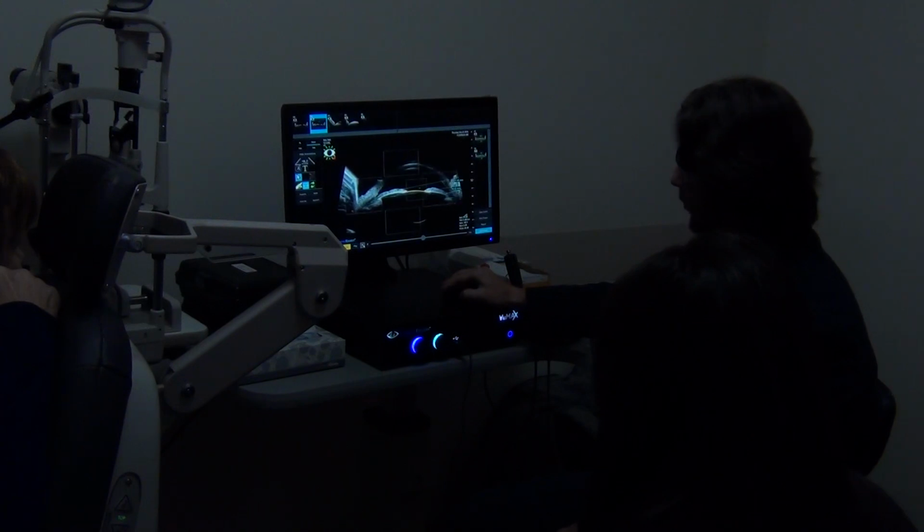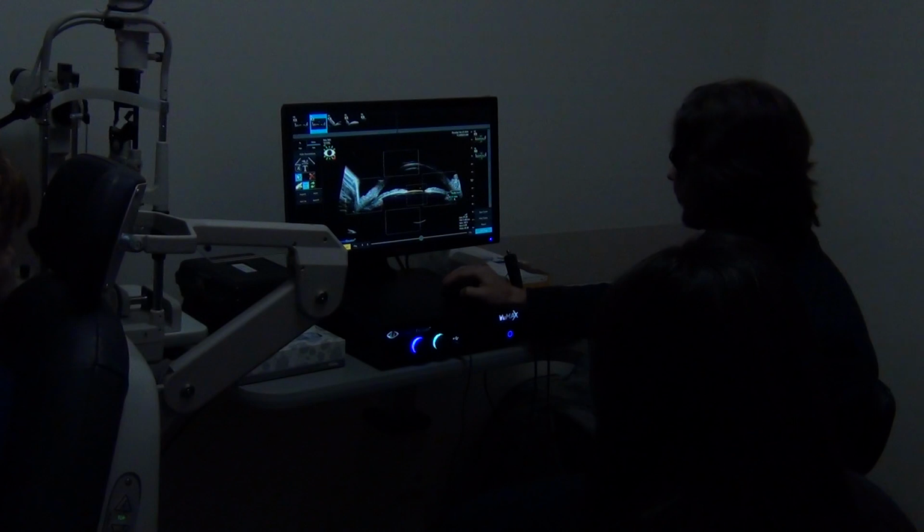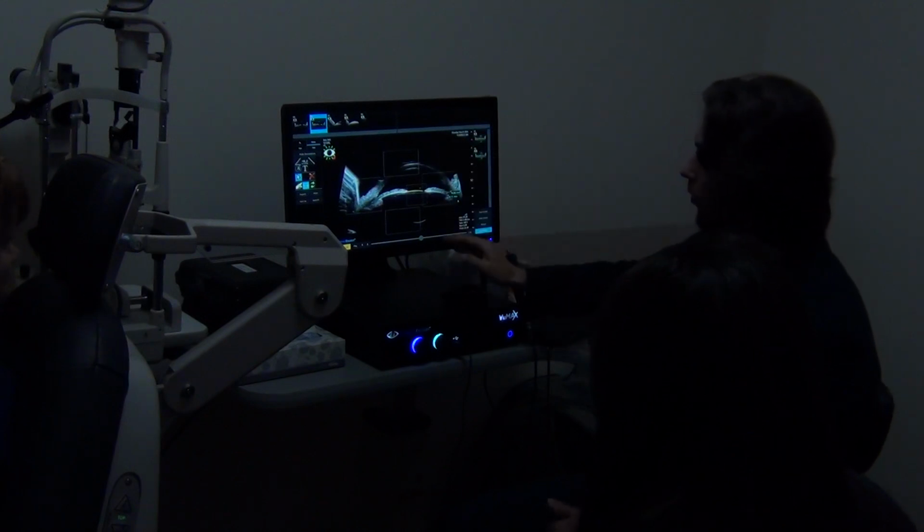So again, we go frame by frame. And we'll get to the points here. And again, we run 10-11. So it's very accurate once you are on that visual axis.